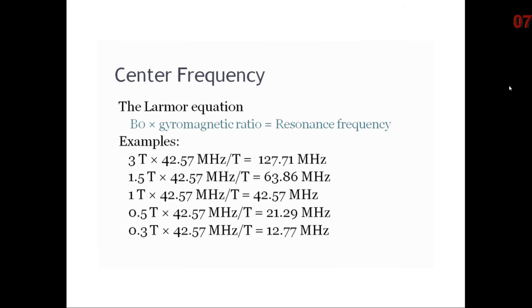To test the center frequency, set up the ACR phantom in the center of the magnet. Use the ACR T1 weighted axial sequence and run a pre-scan. Record the center frequency on the required form. You may need to repeat the pre-scan if your prescribed action limit is exceeded. If the action limit is exceeded again, you must report a change to the service engineer and medical physicist.